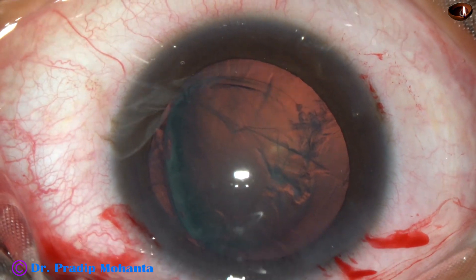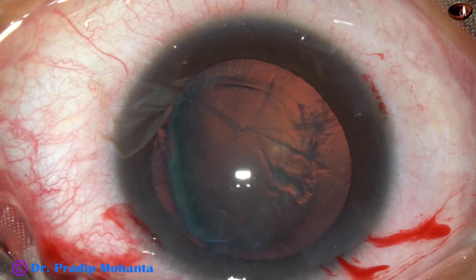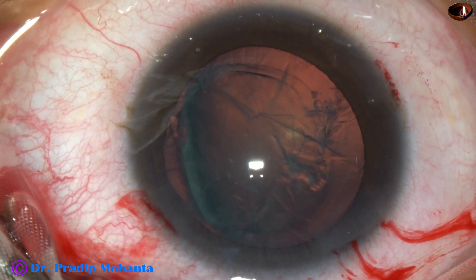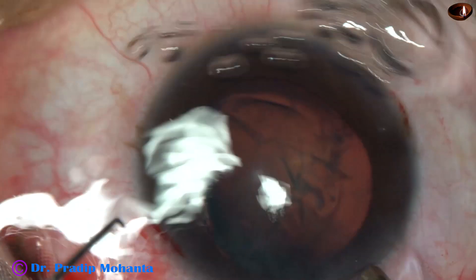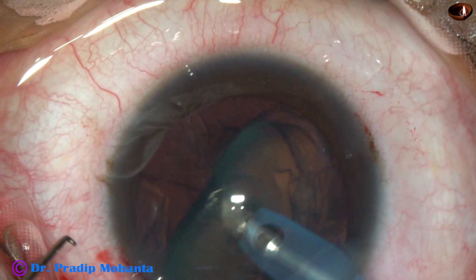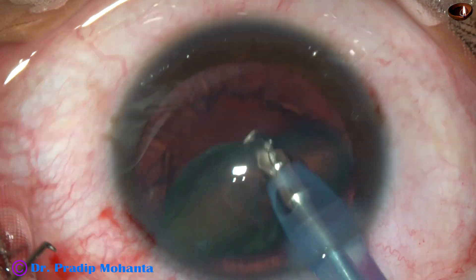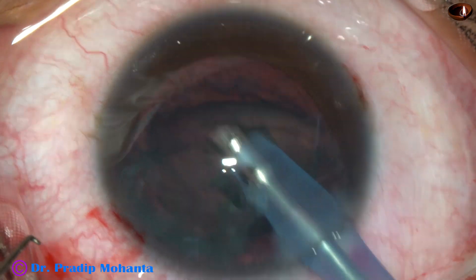Just eat it up. Face the lens mass with the phaco needle and just eat it up. In this case, I decided to go only with the phaco needle and keep the chopper outside. If the chopper is required, I will go in; otherwise, I will just remain out. Now see what happens — as I start eating off the lens mass, it is a soft cataract, and the whole thing gets eaten off in just a few seconds.